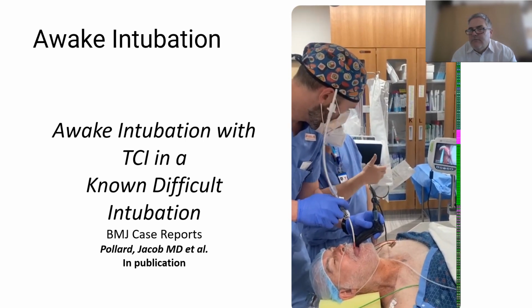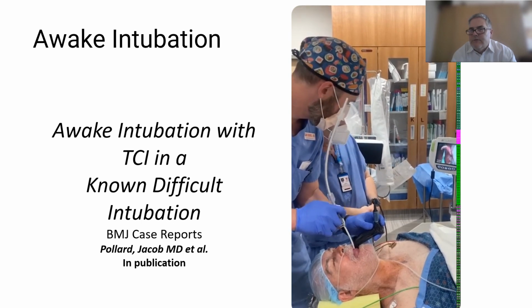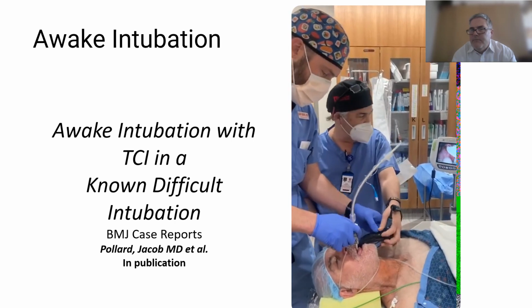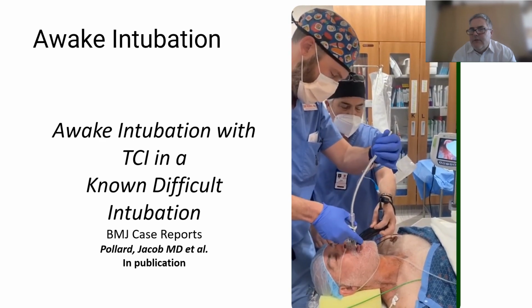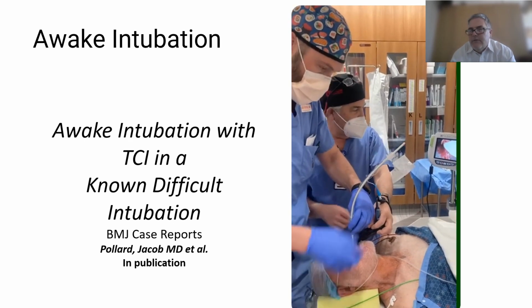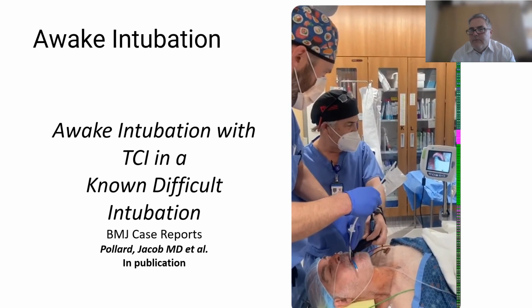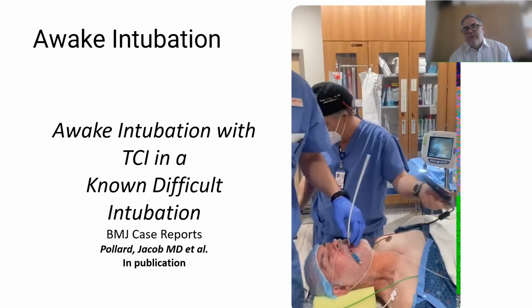Primary curve solved. Very intuitive visual fields to work in. Secondary curve is solved. Little coughing as we enter the trachea. Single operator up till entry of the trachea. Handle is removed. And the endotracheal tube is railroaded. Very easy technique. It's his first time. He executed it perfectly. Very easy to learn.